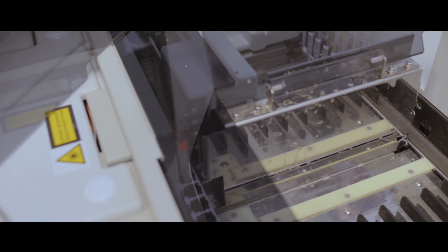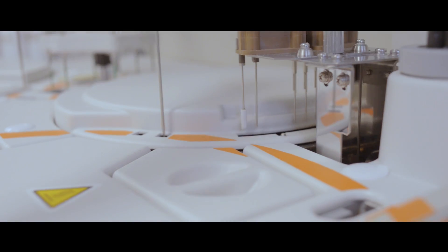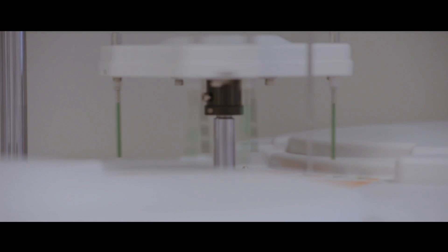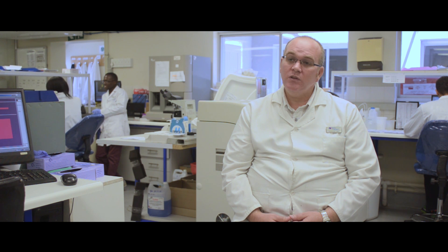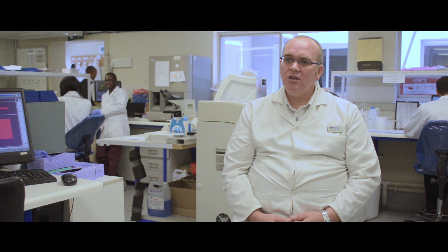The second part of the laboratory makes use of what we call clotted blood. We spin it down to separate the liquid part from the cellular part, because the chemistry test is actually performed on the liquid part of the blood. We take it and load it onto the instrument — over there we actually take the cap off before loading it.